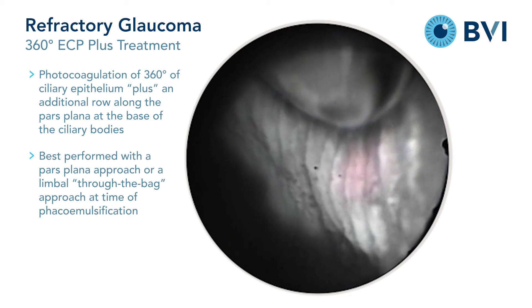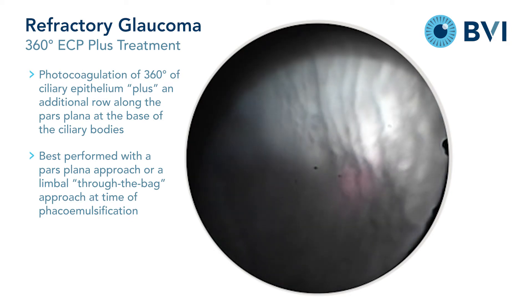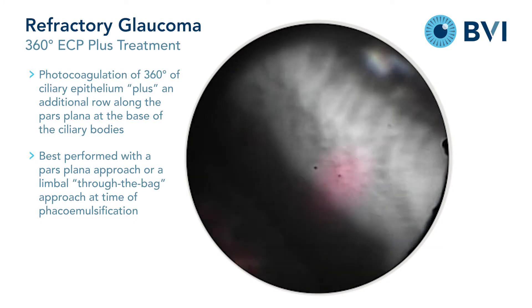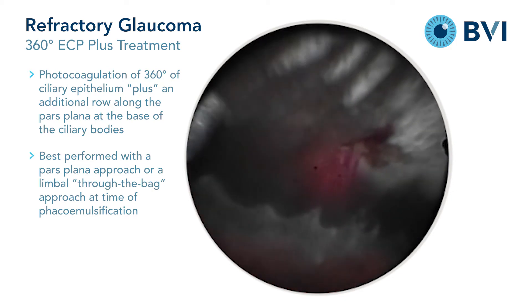The goal is to laser 300 to 360 degrees of the ciliary body, intensely white, and also to create a confluent row of photocoagulation lesions on the pars plana as well.